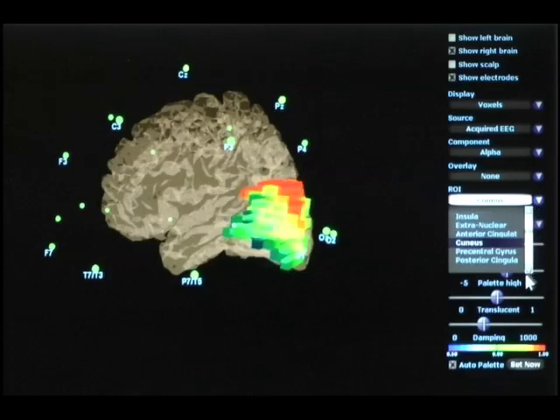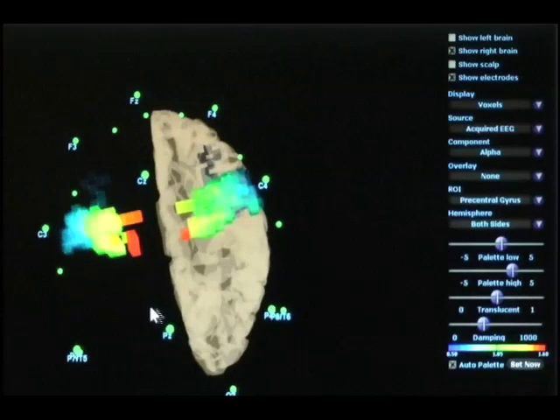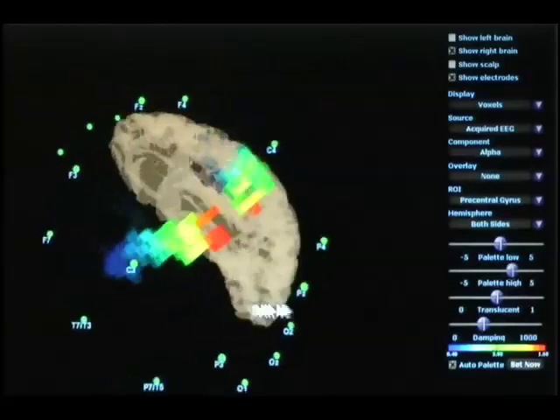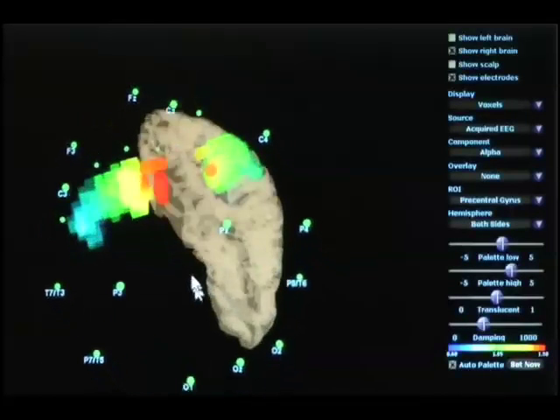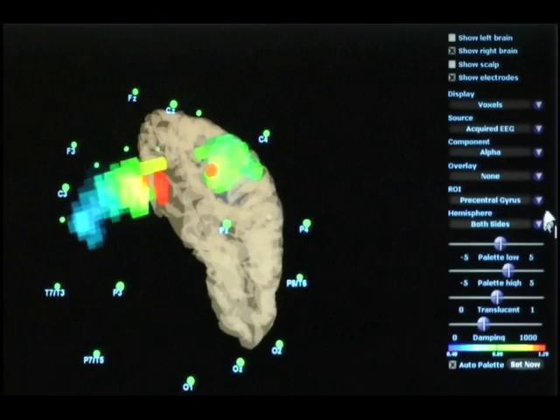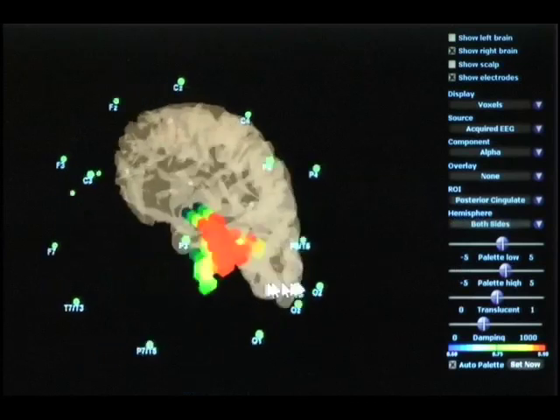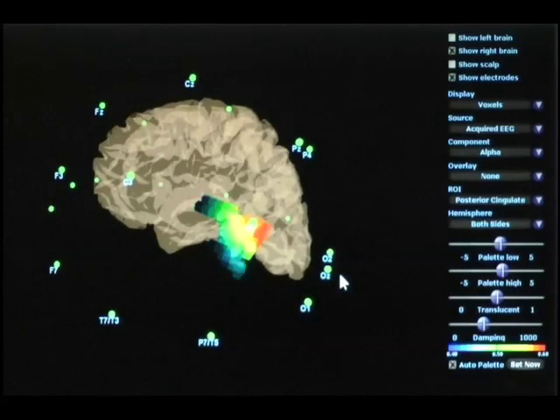And posterior cingulate. Again, a very important region, confirming that the alpha activity we were seeing is predominantly parietal. Here's the posterior cingulate and its involvement in that activity.